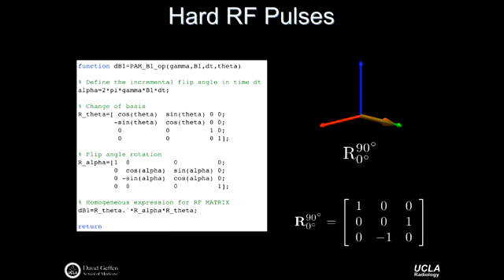Where this gets to be more interesting and harder in some sense is if you have a flip angle of 11 degrees and a phase of 45, right? I can't do that in my head, right? But fortunately, I know how to calculate it now. And so if I gave you a problem and said, oh, I need to phase my RF pulse along 33 degrees with a 15-degree tip angle, you could tell me where the bulk magnetization is going to end up.